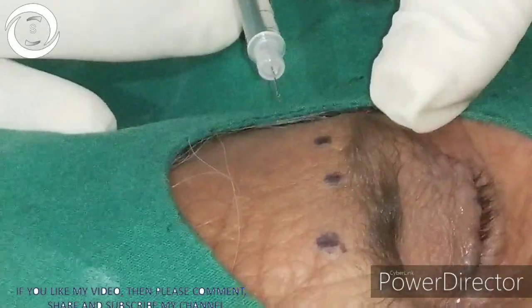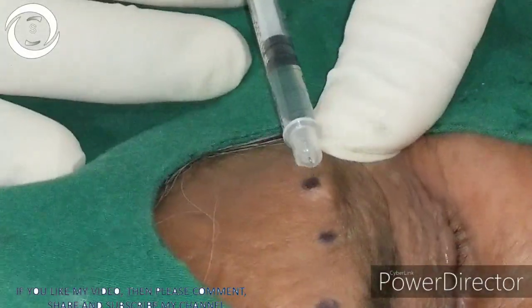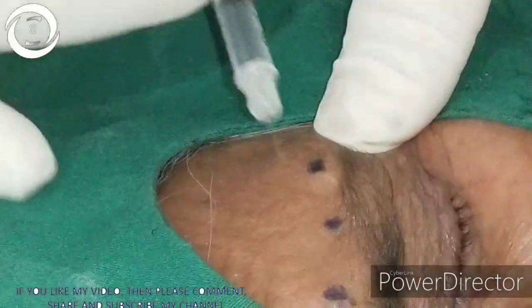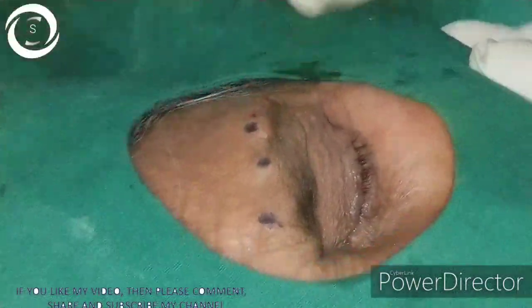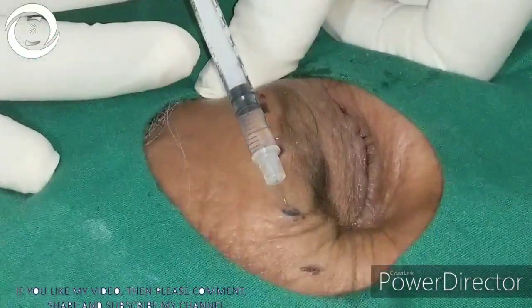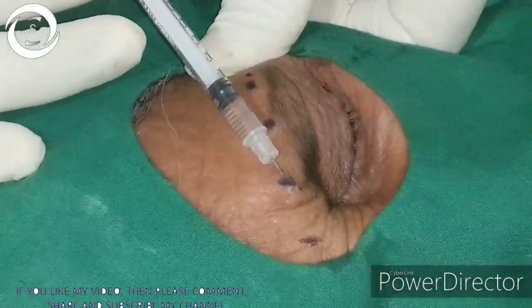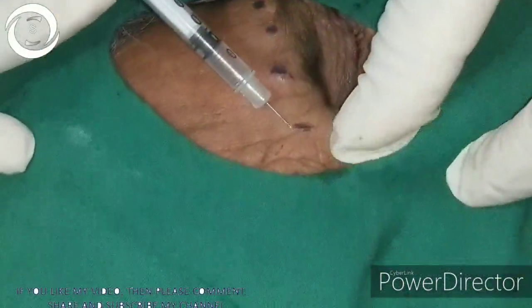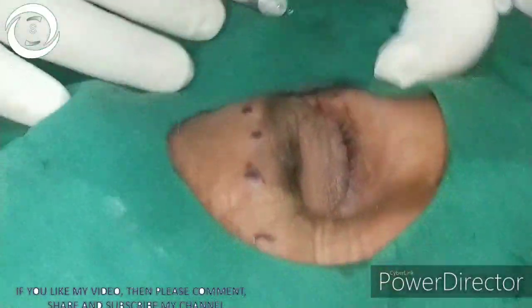Now we are injecting in the other eye. You can see how the injection is administered, and I am making sure that the injection is not too deep. You should also ensure that it is not placed in a vessel. That's the process. Thank you very much.